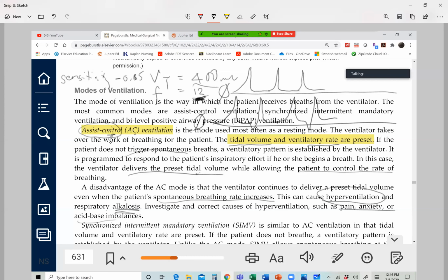How many breaths are you giving now? So the patient receives 10, right? If the patient gets better after drawing ABGs, which is the only thing you can do because the patient most of the time is sedated, you constantly evaluate the ABG.